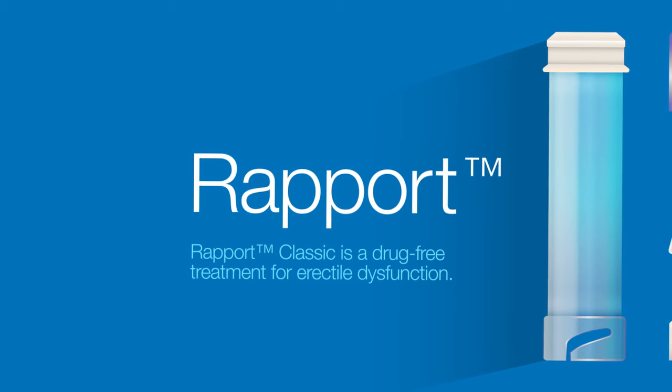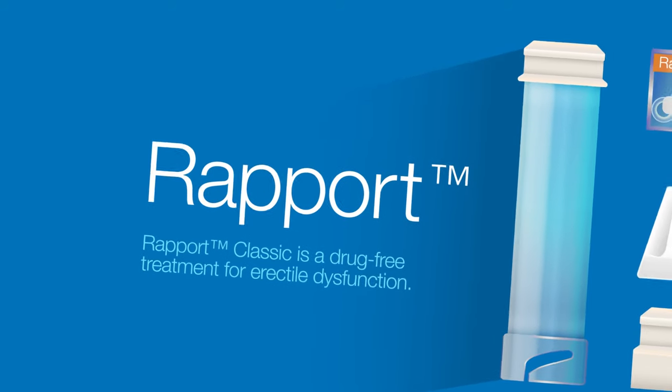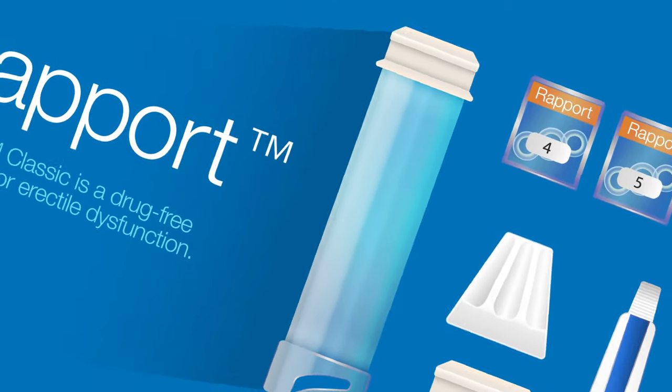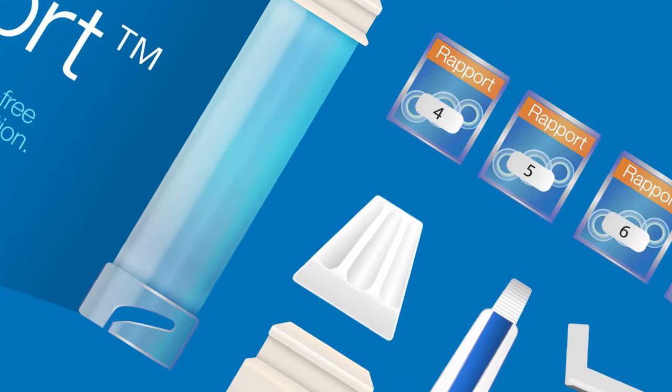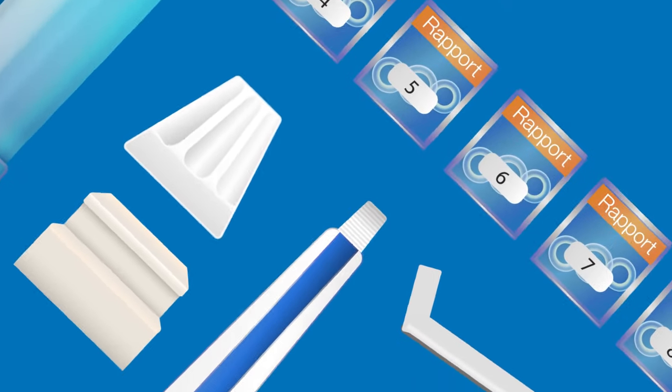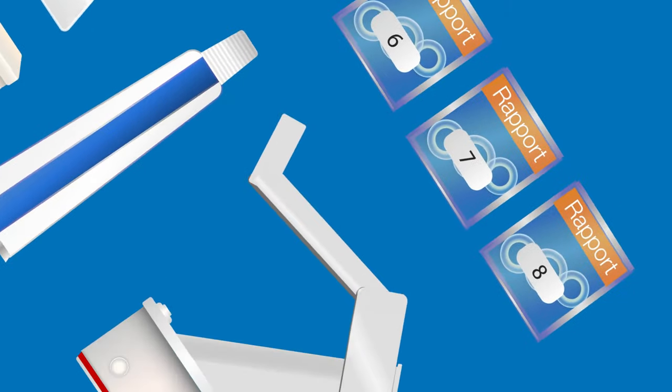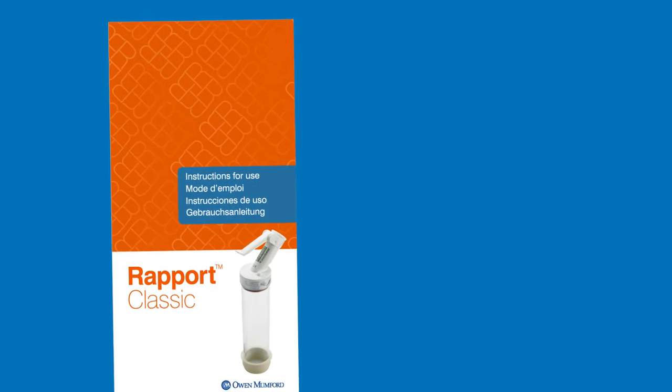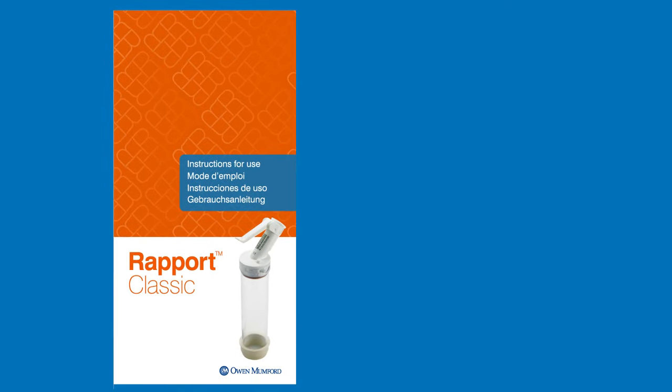Before you start, familiarize yourself with the contents provided in your Rapport Classic Vacuum Therapy device system. You will find the constriction ring sizing guide at the back of your instruction for use booklet.